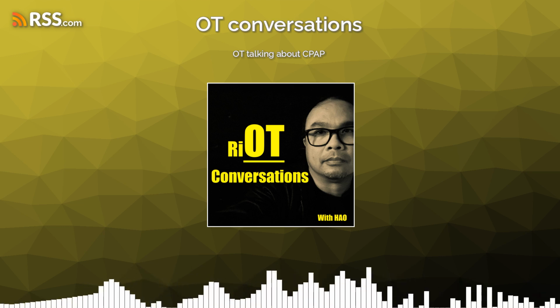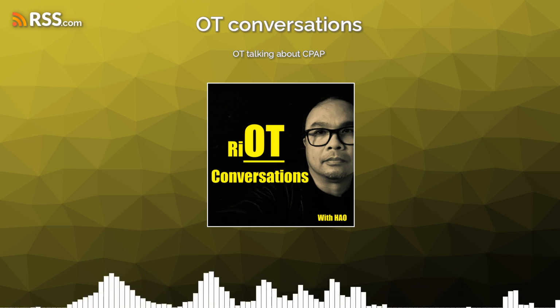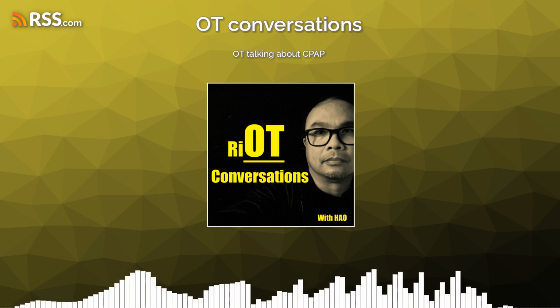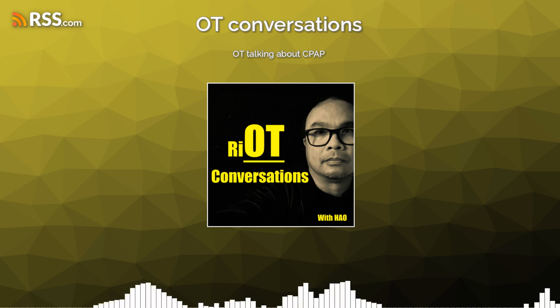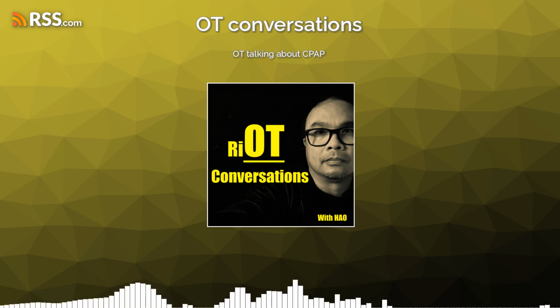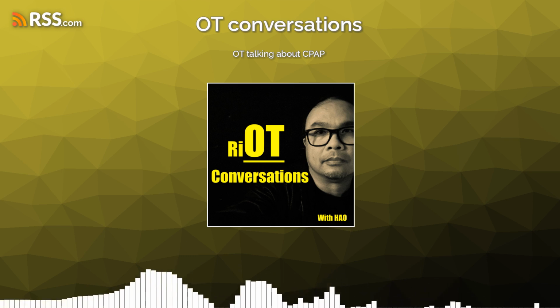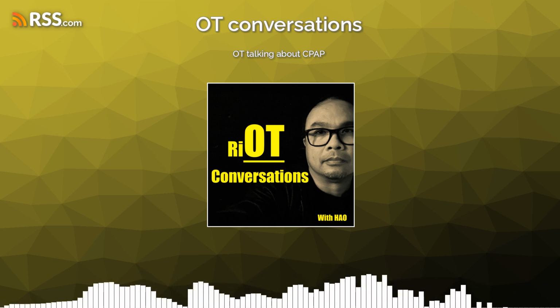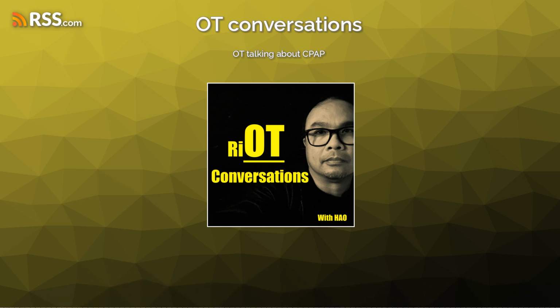So with sleep apnea, like I said, the airway repeatedly becomes blocked. And when this happens, it limits the amount of air that reaches the lungs during sleep. What CPAP does is that it helps the person by keeping the airways open, and it improves the breathing. Let's have an overview of how it works. We'll talk about the benefits and some of the considerations for you guys.